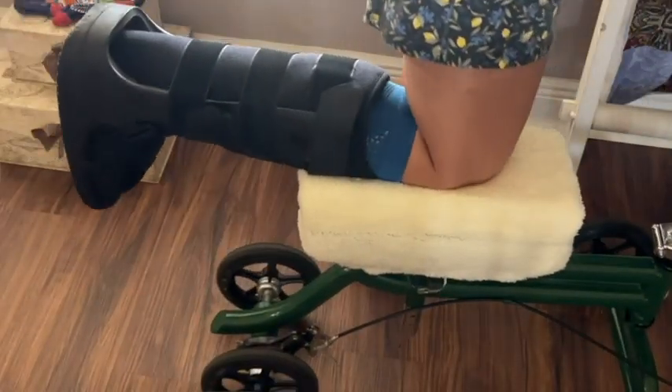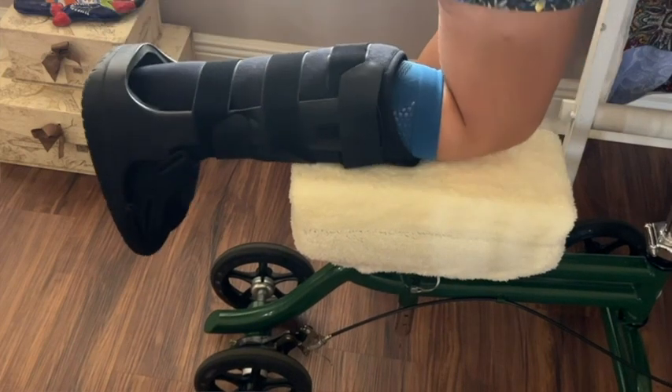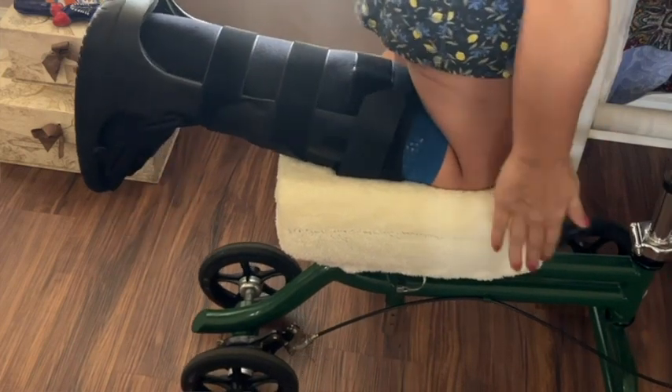It's important to me to feel stable when I'm using my scooter, but I also wanted that extra support — and with this cushion I get both.